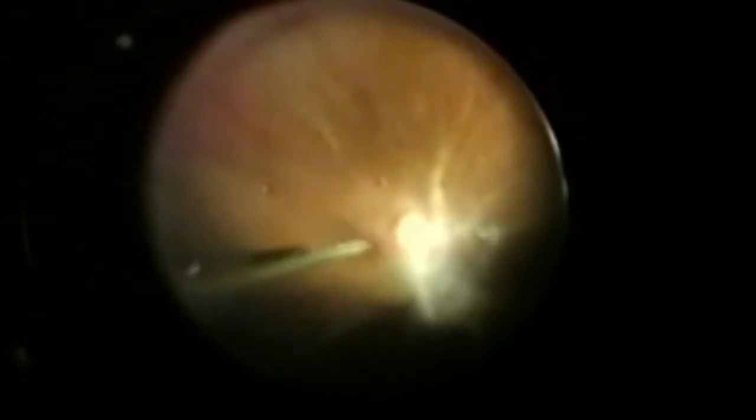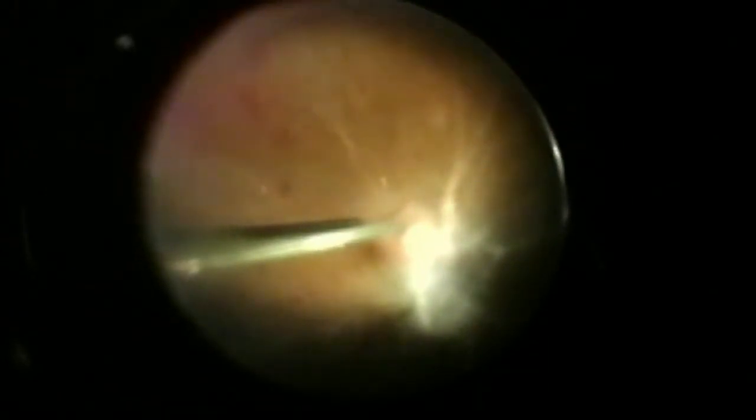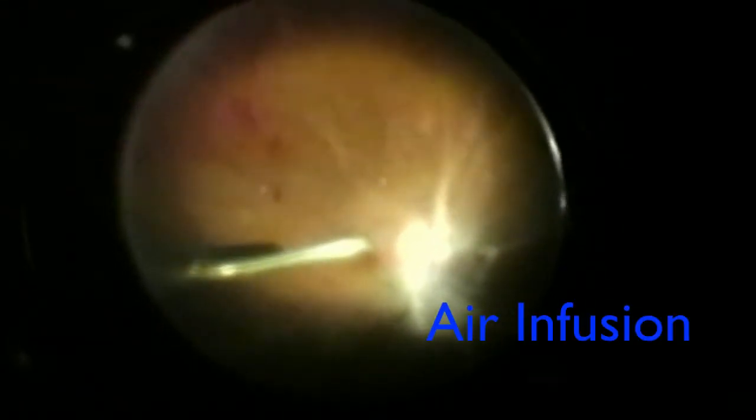The blood vessels are pretty white in this patient, which means there's not a lot of blood flow, and again that plays into how aggressive we want to be. You'll see the air bubbles coming in — that's the air-fluid exchange — and then you'll see the bright green laser spots, which is called pan-retinal laser photocoagulation, a mainstay of this procedure.